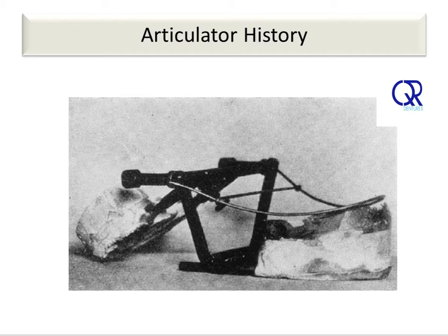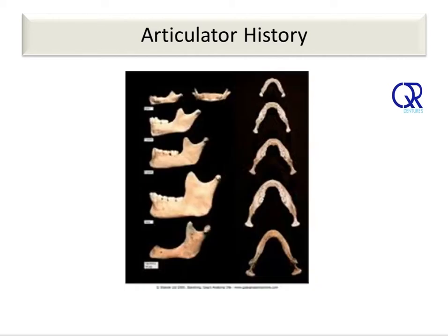This first demonstration of his spherical theory was performed with a Bonwill articulator, and the casts were mounted according to Bonwill's instructions. However, departing from Bonwill's concepts, the teeth were set to conform to a wire spherical occlusal guide constructed by Monson, as you can see in the picture. Through further studies, Monson concluded ideally that prenatal mandibles tend to develop as equilateral triangles, and if the various interfering factors can be controlled during development, that tooth occlusion would also conform to a sphere.